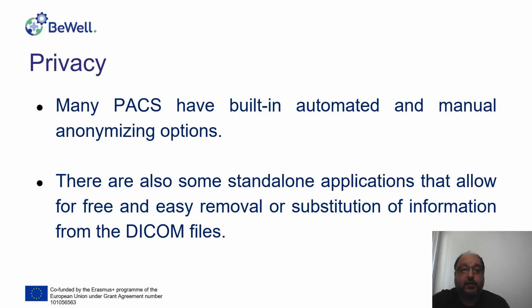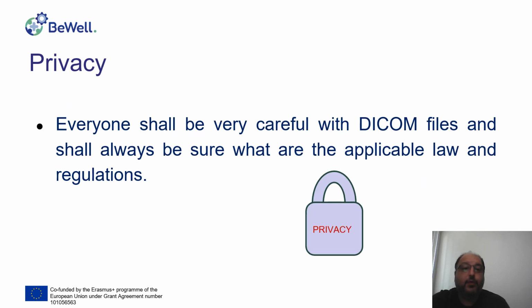Many picture archiving and communication systems have built-in automated and manual anonymization options, and there are some standalone applications. Some of them perform free and easy removal or substitution of the information from the DICOM files. So everyone should be very careful with these files and be always sure what the applicable laws and regulations are.